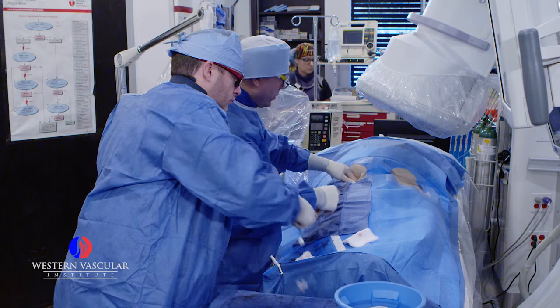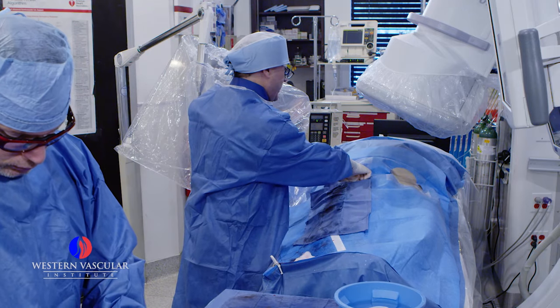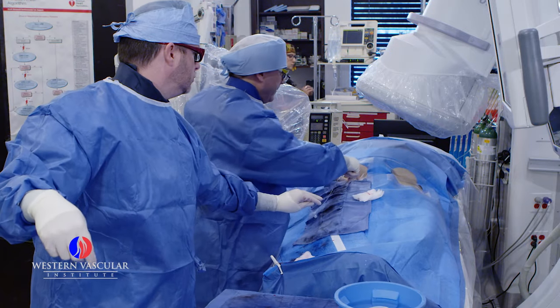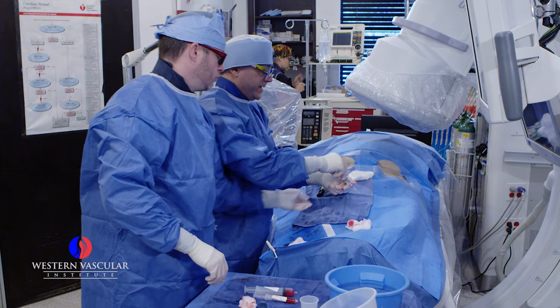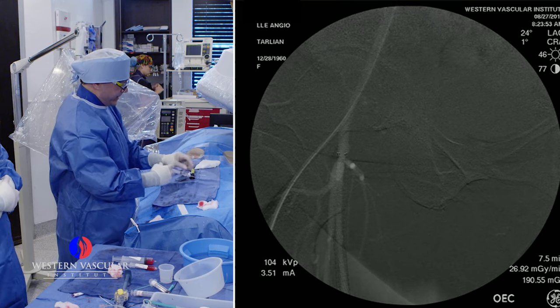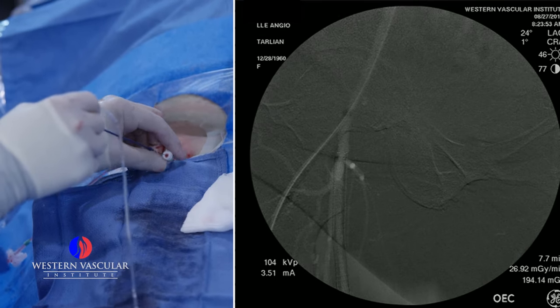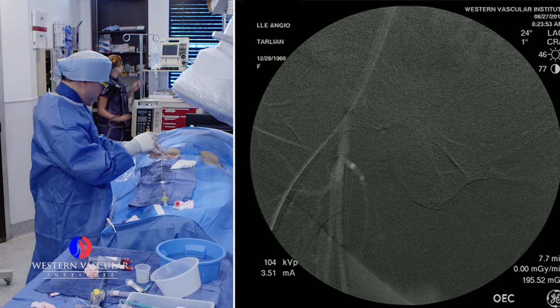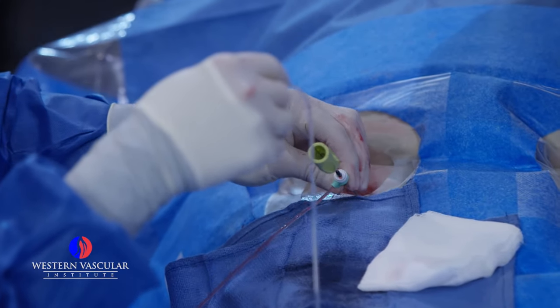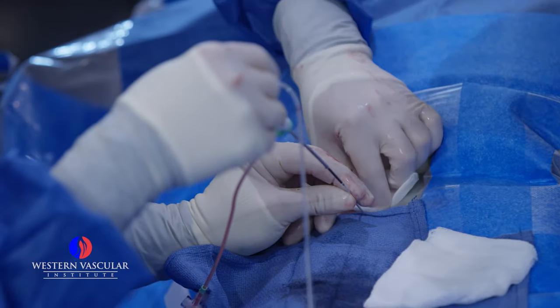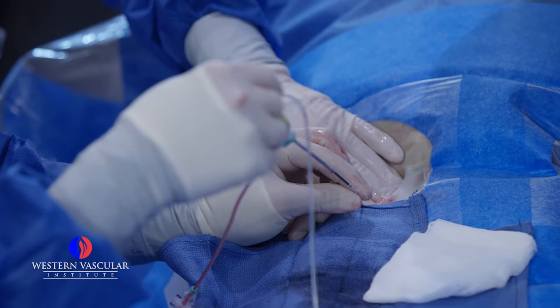Right now we're taking this sheath out and putting a shorter one in so that I can put a closure device in the groin. That'll close the artery in the common femoral artery area so that we can make sure we have what we call hemostasis, which means no bleeding from the groin. Now we're going to put what we call a Mynx closure device in. This device has a little balloon on the end that we inflate. We pull the balloon back until you can see it, and then we pull the sheath back until it doesn't want to come out anymore — that's how we know the sheath and the balloon are up against the wall of the artery. Then we advance the device and apply a little bit of pressure on the plug. We let this sit for 30 seconds or so, and then we'll take the device out and hopefully we'll have hemostasis.